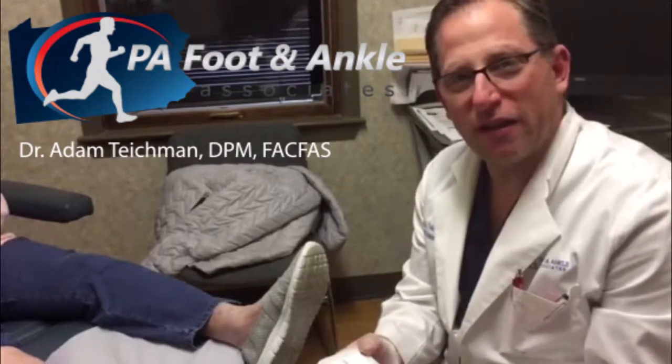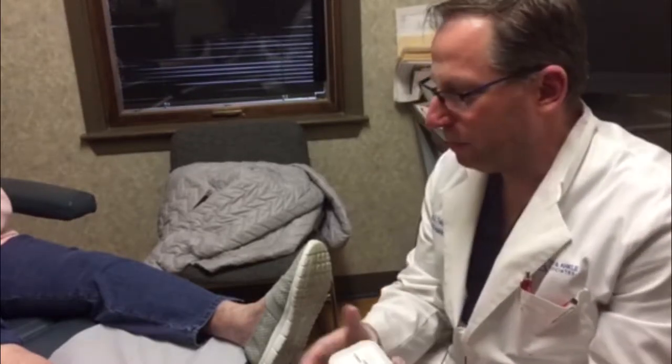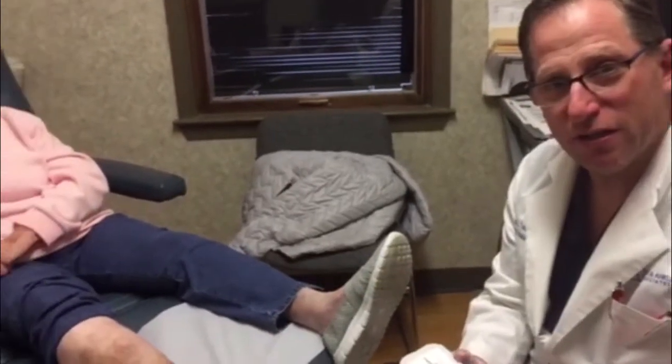Hi, I'm Dr. Adam Teichman with PA Foot and Ankle Associates. Today we're going to be doing a bioengineered skin graft made of amniotic and embryonic tissue applied on a venous leg ulceration.